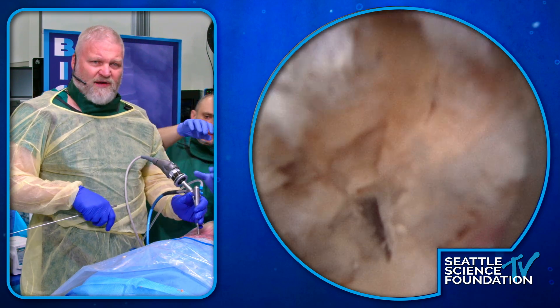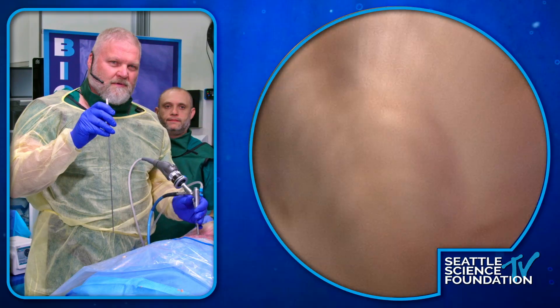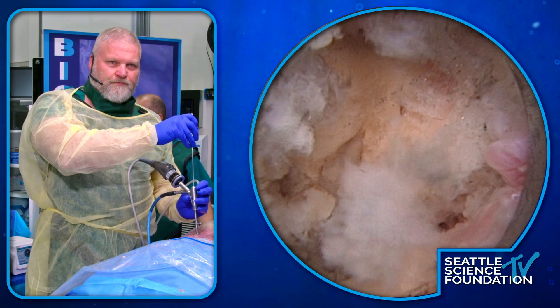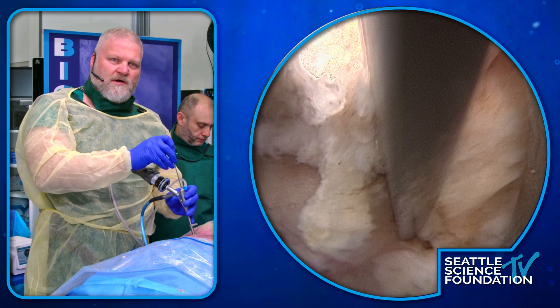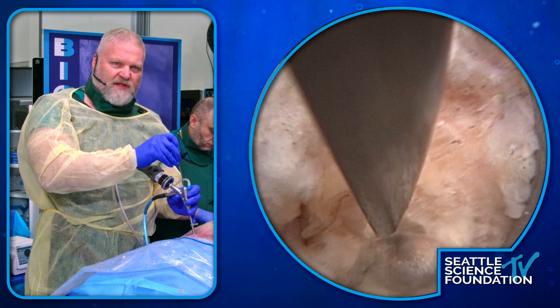Hey Ray, can you focus the camera a little bit? We can't really see. There you go. So you can see where the bone scalpel was going in there.